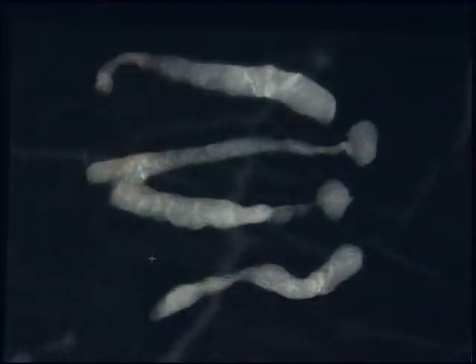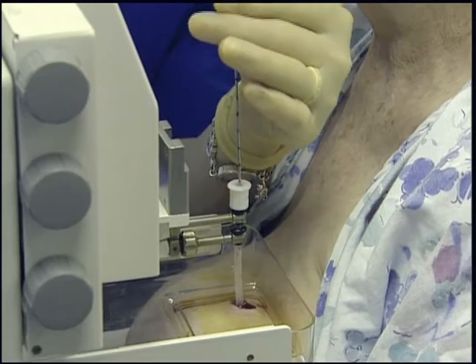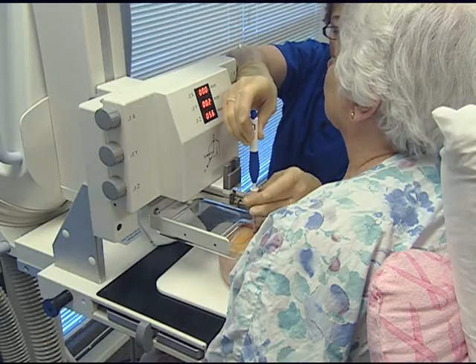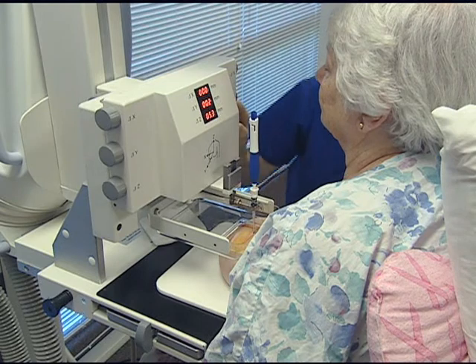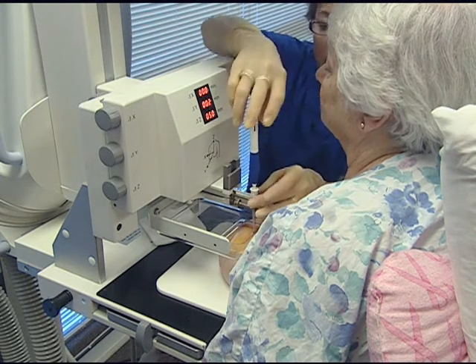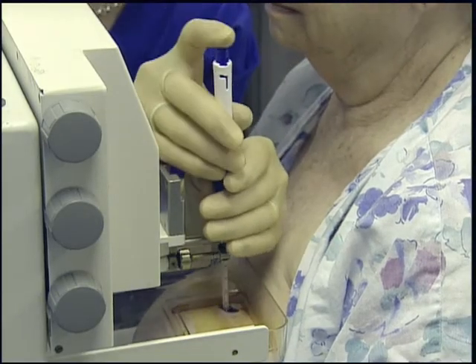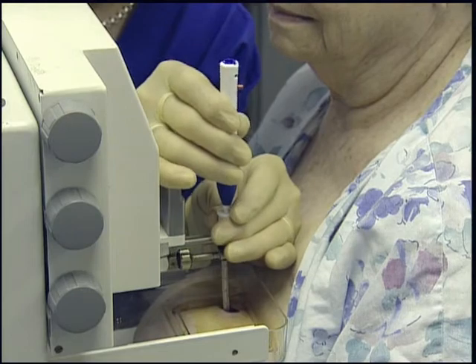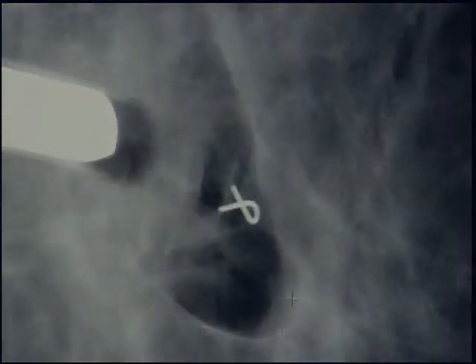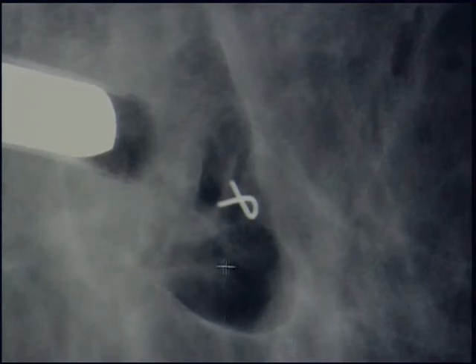The only thing left to do now is to place our tissue marker. This is called an UltraClip. We just position that — I usually like to pull this up a little about five millimeters. Let's get that down there and now we just advance this all the way in. I very gently push the button down and it deploys, then I just twist it a little bit and pull it back up. What we see right here is a nice shot of where most of the calcifications have been removed. We can see a few residual down here, but very importantly our UltraClip is well positioned.